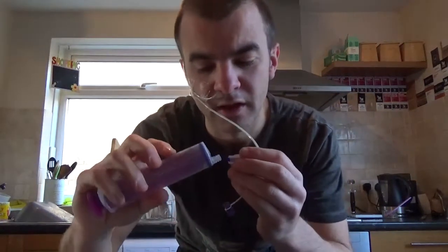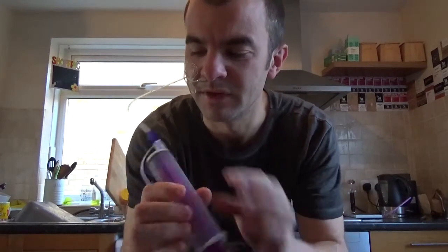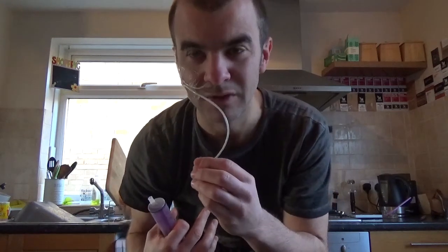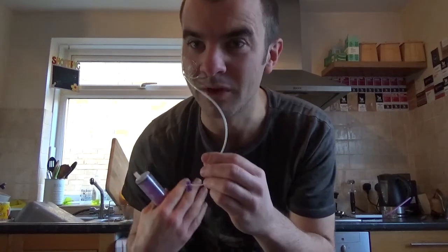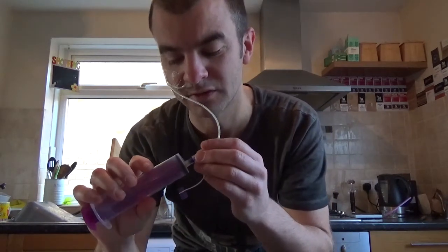I'm going to get an aspirate before I start feeding. The reason we do this is to make sure that the end of the tube is definitely in the stomach and hasn't migrated somewhere else. The one place we really don't want it to go is into the lungs — you'd obviously have lots of problems if you were feeding into the lungs.